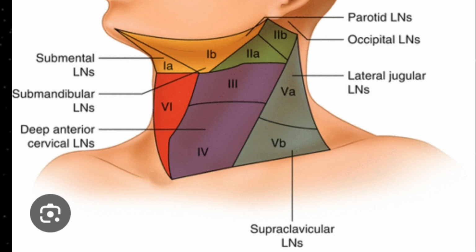While you are doing ultrasonography, you should have sufficient knowledge and anatomical orientation of all these lymph nodes, and while you are reporting, always mention which lymph node is enlarged and how much enlargement is visualized, and try to make a follow-up note so that you can scan these patients after an interval for regression.